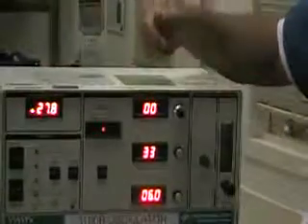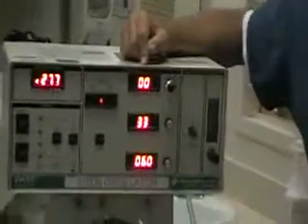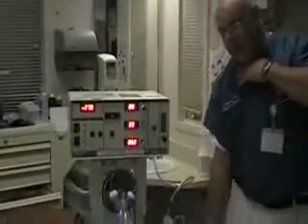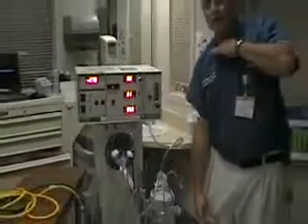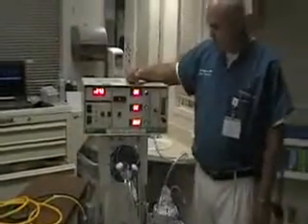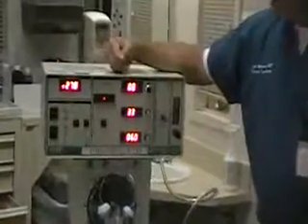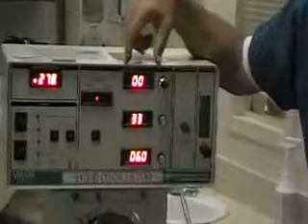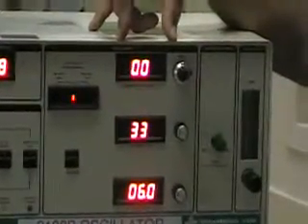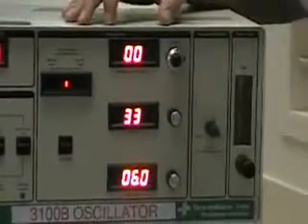As far as our amplitude is concerned, we're going to set our amplitude to get a chest wiggle between our clavicles, which would be here, to our mid-thigh. And you need to be able to see the patient actually moving this far. A great place to start would be just to start at an amplitude of about 90. I know that sounds kind of high, but you really can't think of it in terms of centimeters of water pressure as much as you think of it as chest wiggle. You want to see that patient moving from their clavicles all the way down to the mid-thigh. So a good starting spot for this would be about 90.